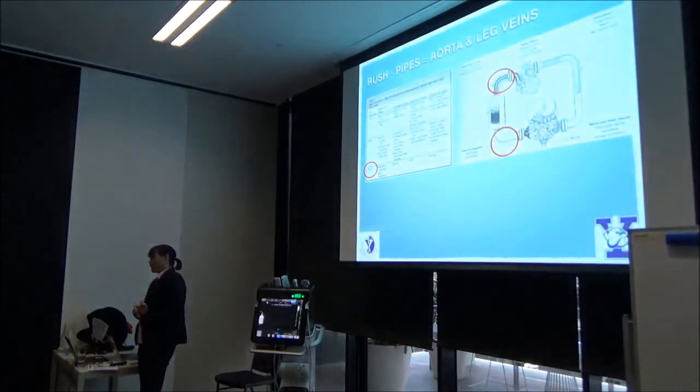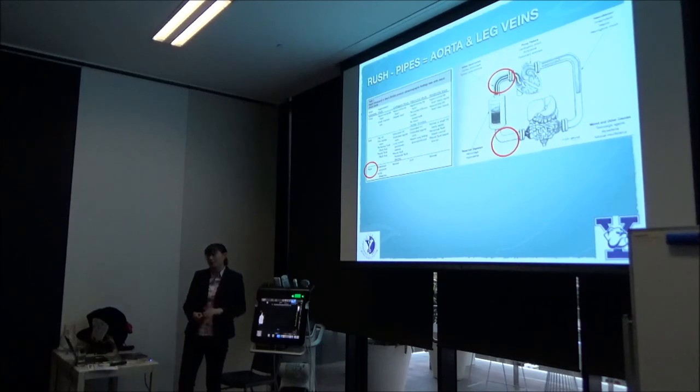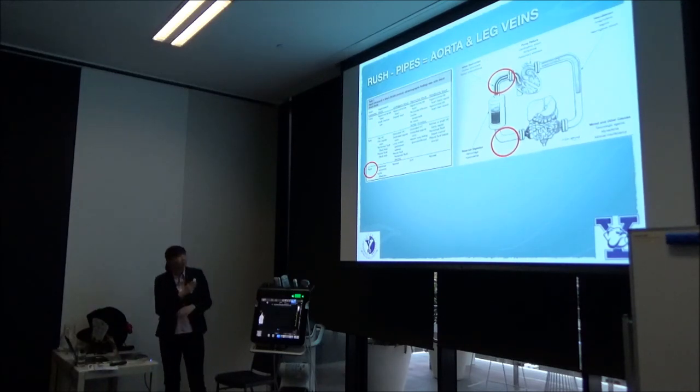Okay, so lastly, we come to our pipes. This is literally the last thing, last-ditch thing. We don't normally get to this point, but if we haven't found an answer, then I might consider going here.